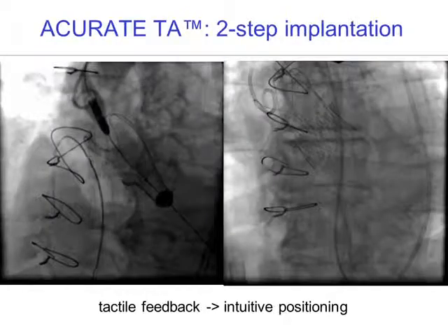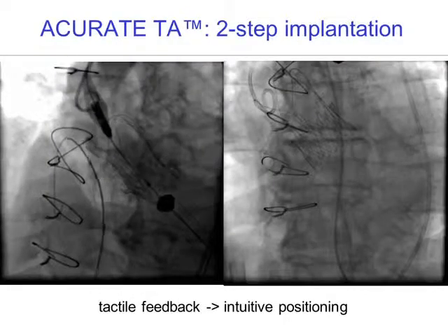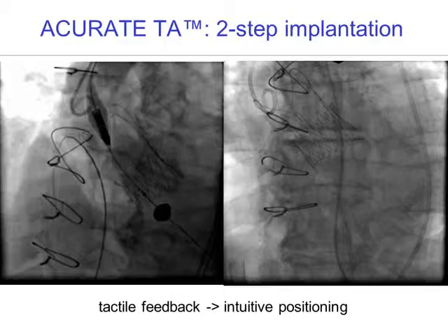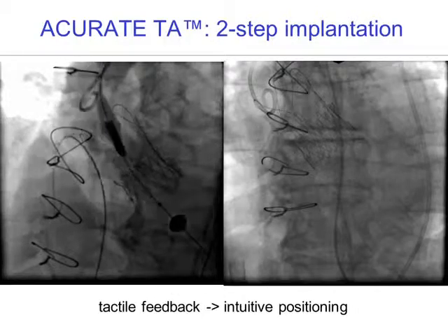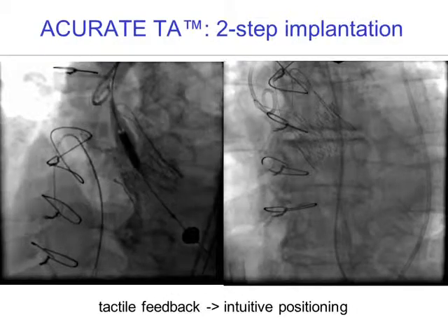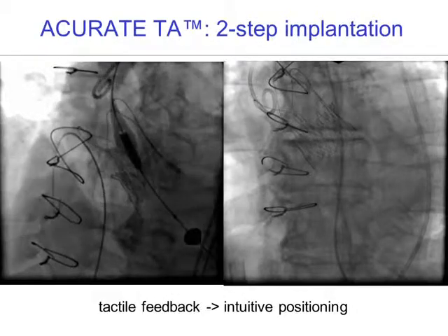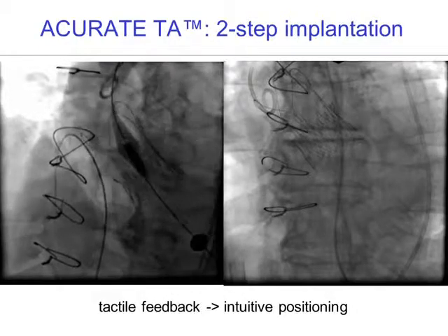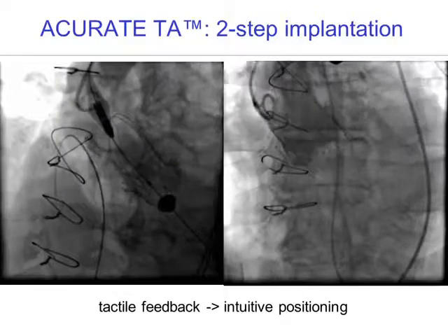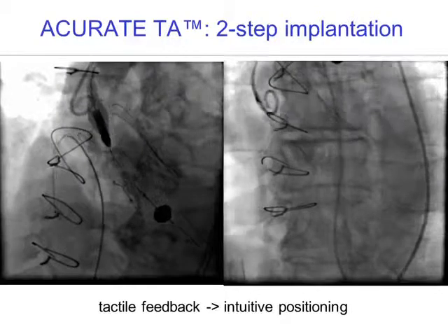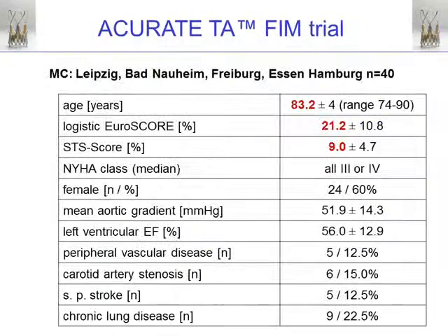On the left, you can see the partial release has already been done and the valve slowly opens. By gently pulling on the device, you then safely anchor it down into the aortic annulus, which led to a good result in this patient.